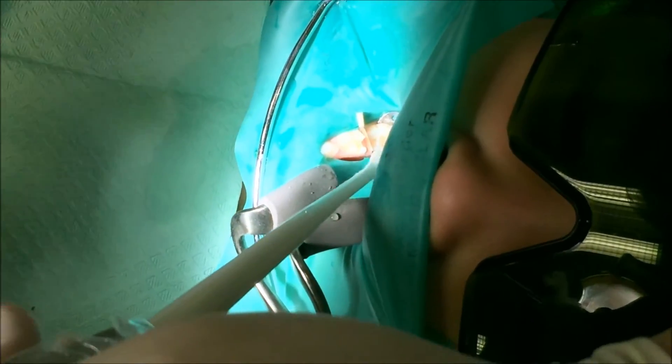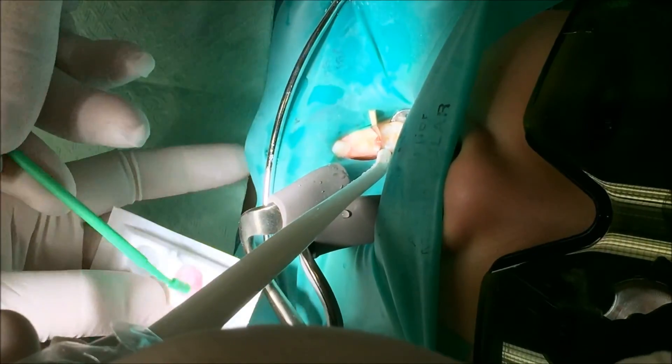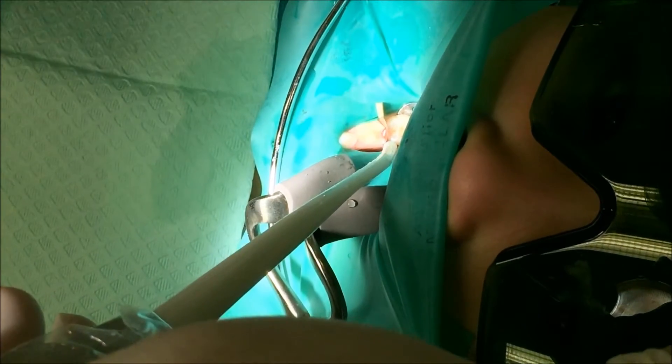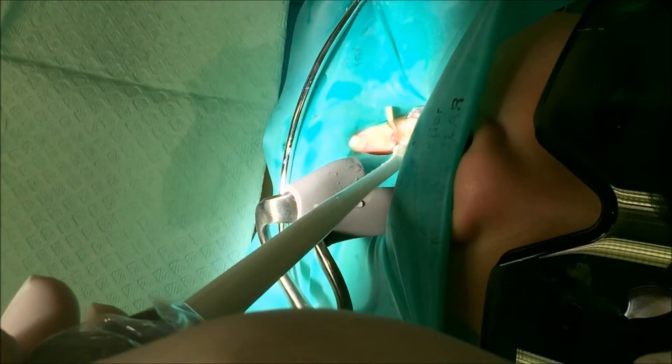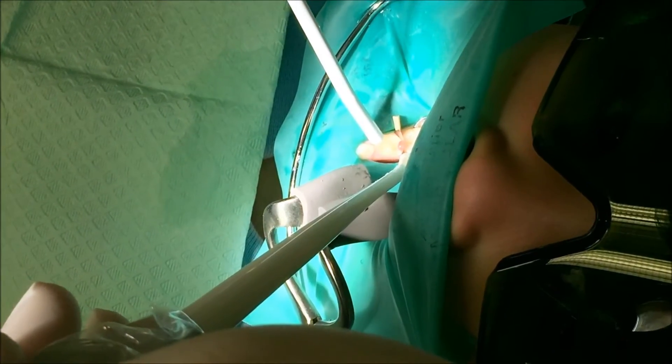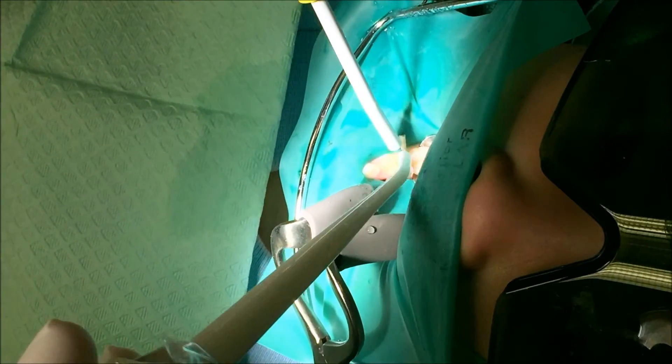I'm going to put the shampoo on. One, two, three, four, five, six, seven, eight, nine, ten. I'm going to rinse it off.